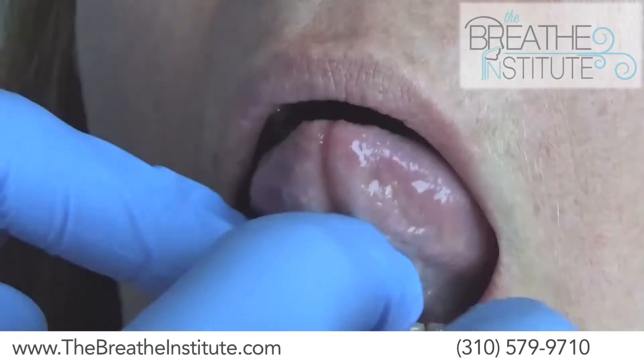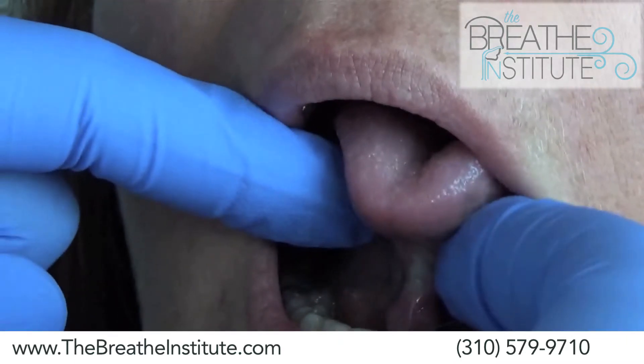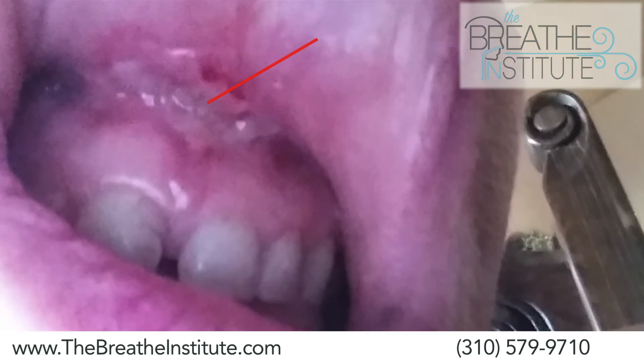This is an actual patient you're going to be seeing today who had two failed lingual frenectomy releases. This photo is taken the day after Dr. Zaghi's lingual frenectomy release. You're also going to see an upper lip frenectomy where the patient already had a failed procedure. You can see the scar tissue here at 10 days is forming and causing it to reattach to the lip.